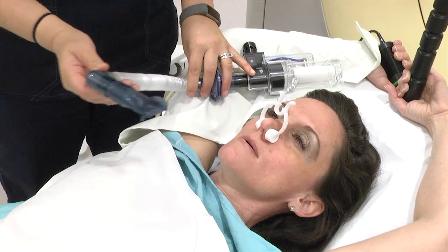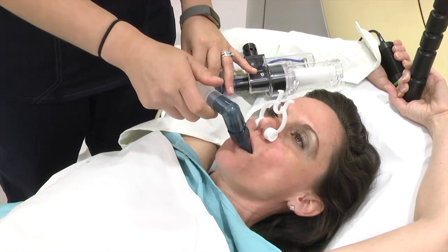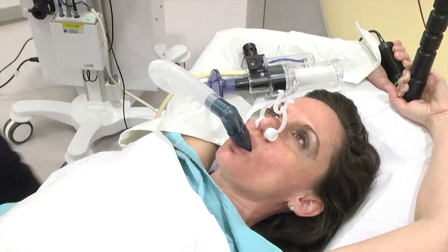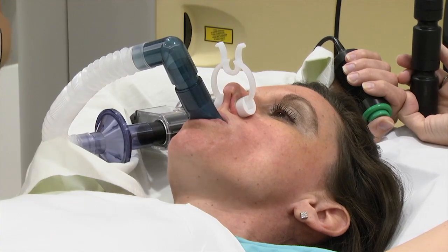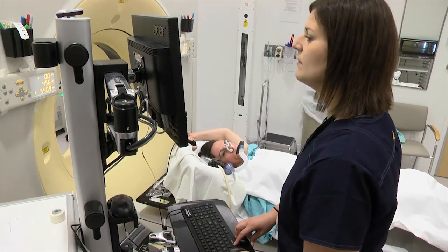ABC is a non-invasive advanced technology that can help you temporarily hold your breath in a consistent way while you are receiving radiation. The ABC device consists of a snorkel, a nose clip, a green button, and a computer. Your therapist will teach you how to use it.